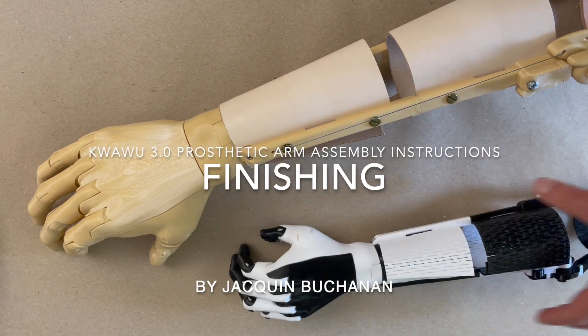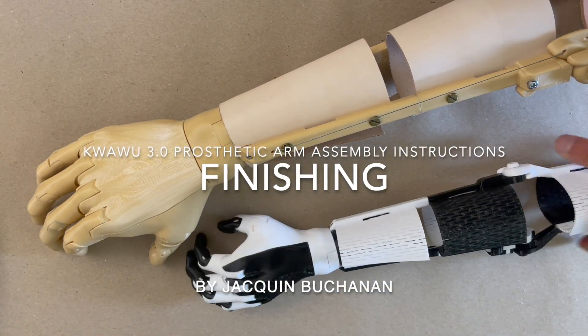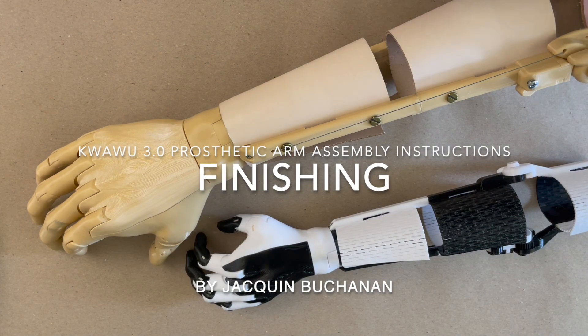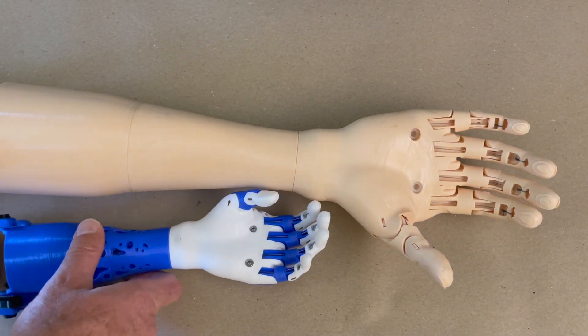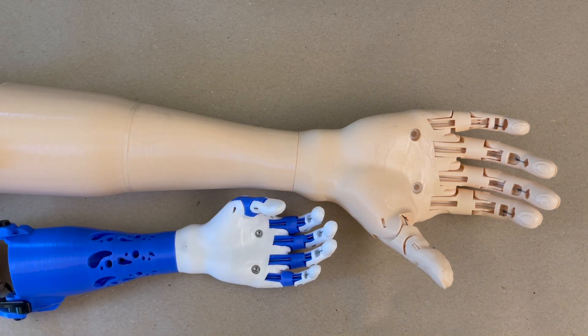Welcome to the final Kwawu 3 assembly video. You should already have put together your hand and your arm, whether it's a wrap arm or a socket arm — that shouldn't matter at this point.